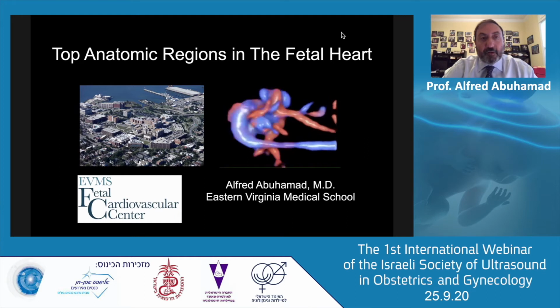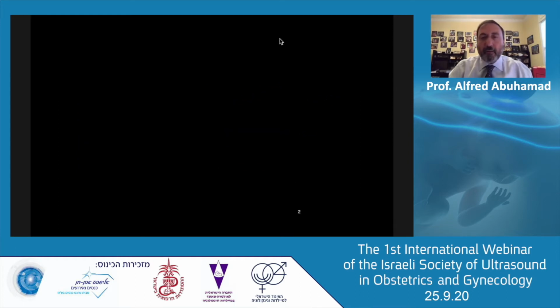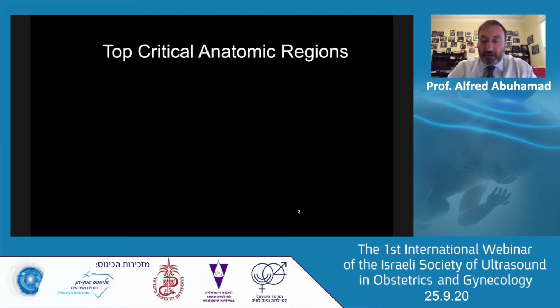And my first talk is on the top anatomic regions in the fetal heart. I am hoping that during this presentation, I will share with you 4 critical anatomic regions that I believe will allow you to detect most fetal cardiac malformations.